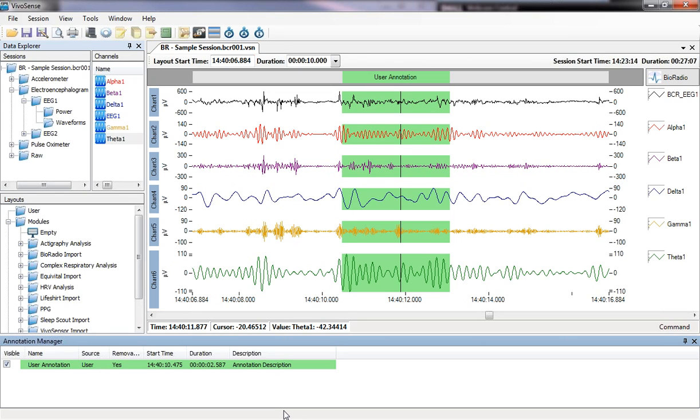It can also be useful for different types of disorder diagnoses. It's actually quite common when diagnosing multiple sclerosis, for example, and looking at the reaction times between presentation of a stimulus and when the brain can actually respond electrically to that stimulus.